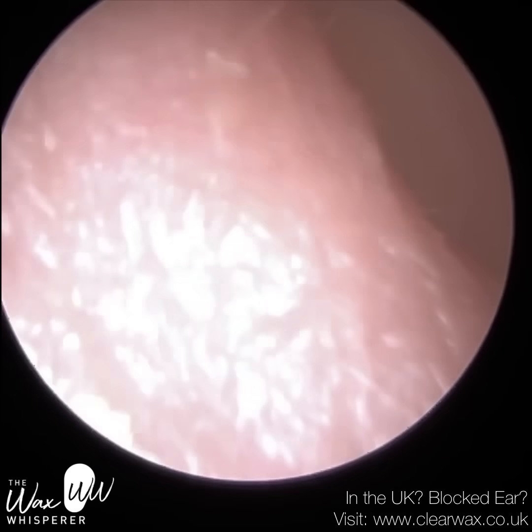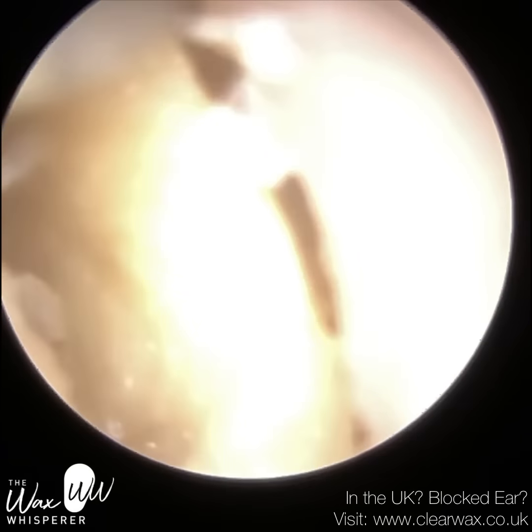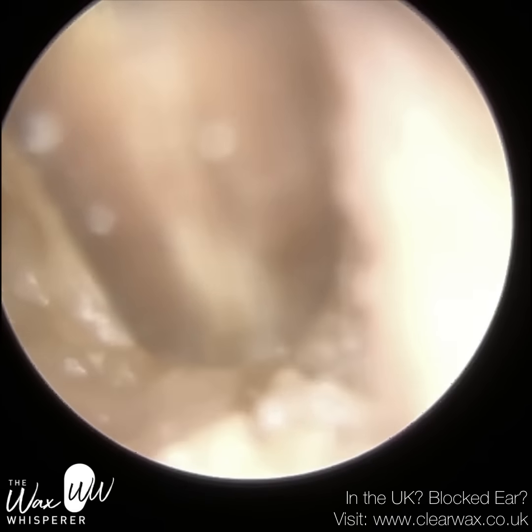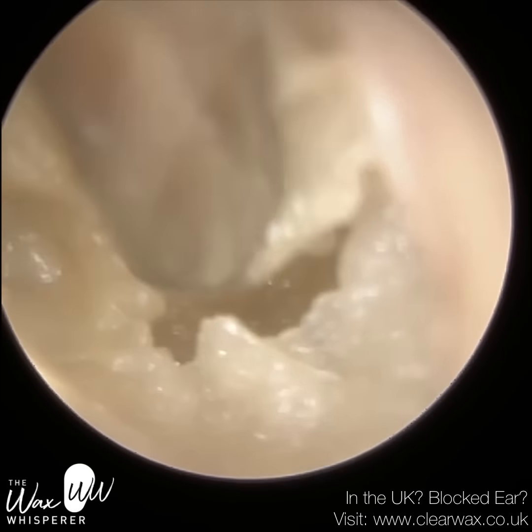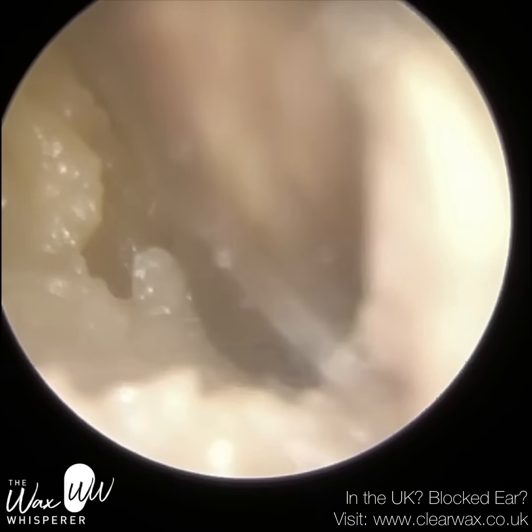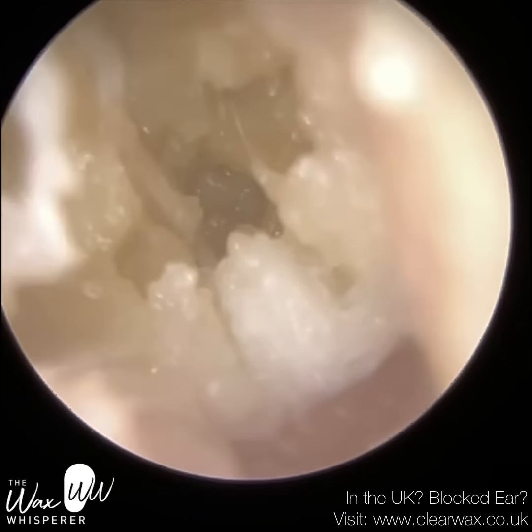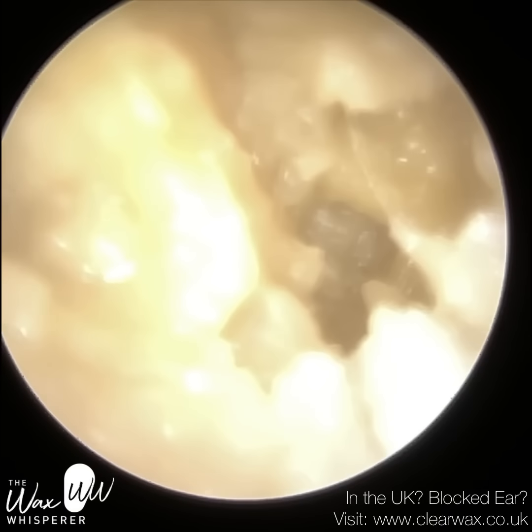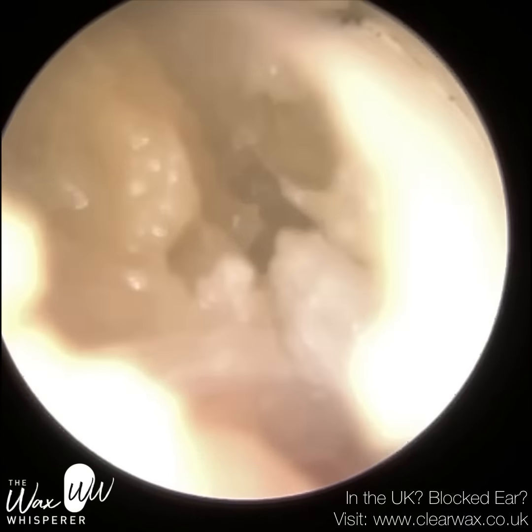Even then I'm really struggling to get in, because as you go in with the suction probe the ear canal gets attracted by the suction, causing the canal to collapse. I've just about managed to stretch it open enough. Now this skin has become quite macerated — some water got in there, you can see it's a lot softer. But also because this ear canal is a lot more narrow and collapsed, it creates a lot more humidity within the ear, causing the skin to macerate. It absorbs the moisture, the skin cells overhydrate, then they burst at the membranes, and it becomes mushy like this.